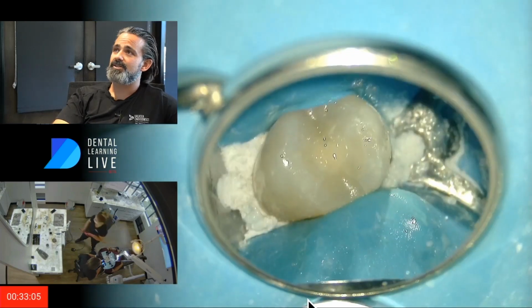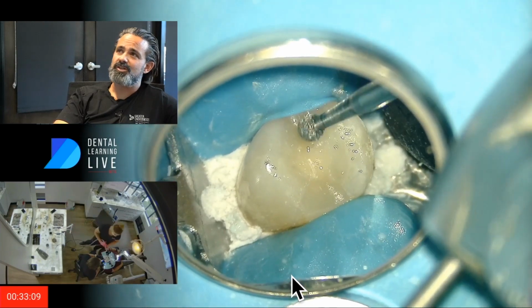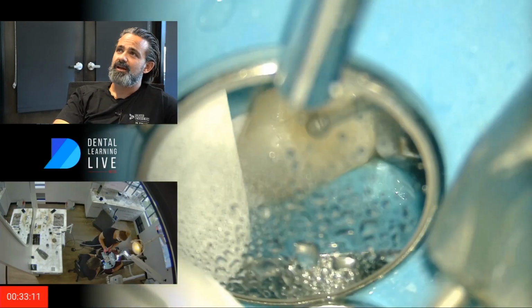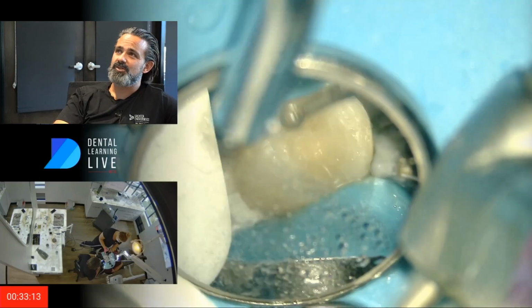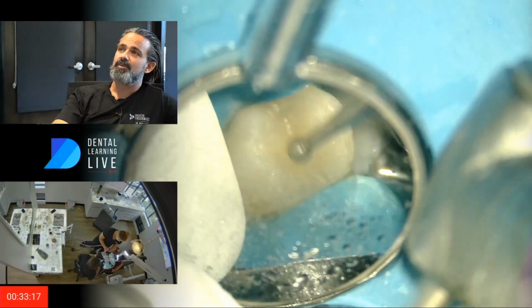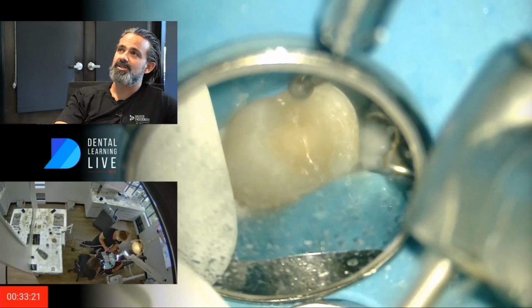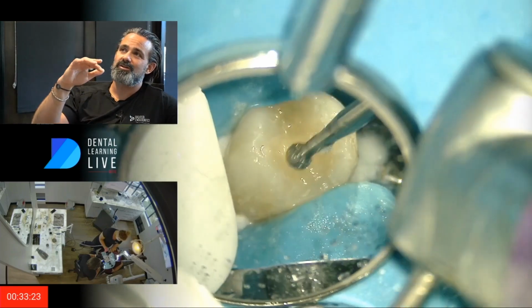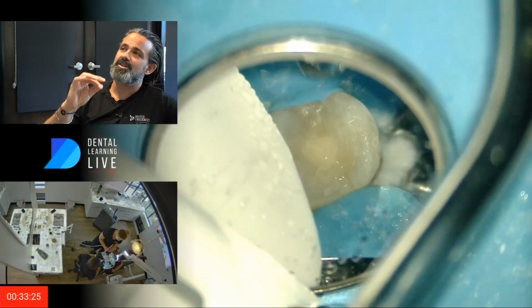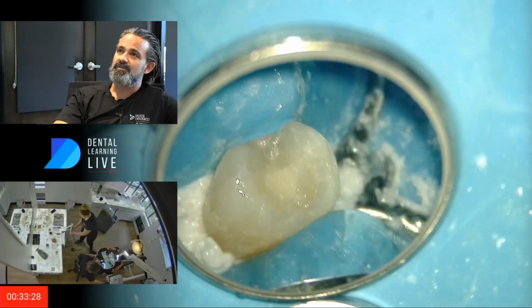All right, so now that that's cured, we'll take a look at it. And sometimes if it sweats, you can re-cure it if you feel like it's not. I'm just taking a little round diamond, making sure there's no flashing or excess bond. If you got a little liberal, a little juicy with your bonding agents, you can take off that, because it will cure and just be rough to the touch and it will mark. So I'll just make sure there's no flashing up there.